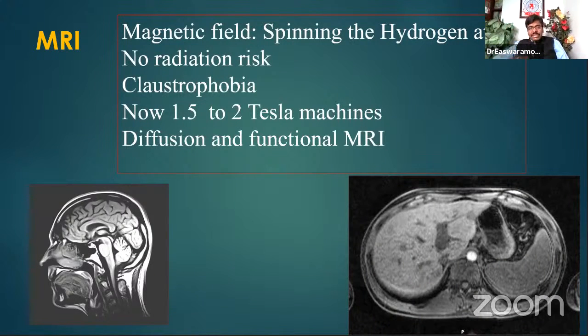So usually they have a metal detector before you enter, but at least you should know if the patient has any pacemaker, or any implant like a hip joint. You have to tell. Some recent titanium implants cannot be a contraindication, but it is still important. Or mechanical valves in the heart. Sometimes those days we had to put metal valves also. So those people are contraindicated for MRI.